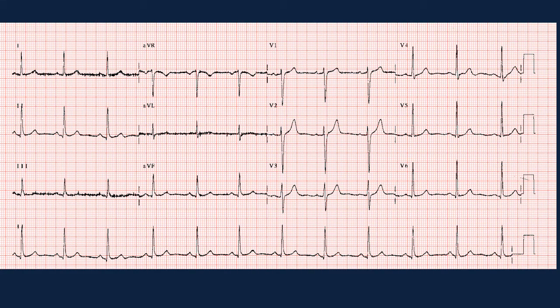Okay, to check rhythm, I'll be telling you how to check if a rhythm is regular or not. To check if the rhythm is regular, you use the rhythm strip. So the bottom of the page, the really long ones. These ones aren't long; they are really short. But this one is quite long. That's the one you use to check if the rhythm is regular or not.